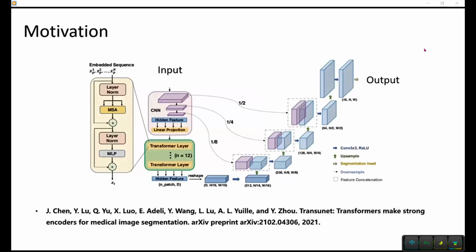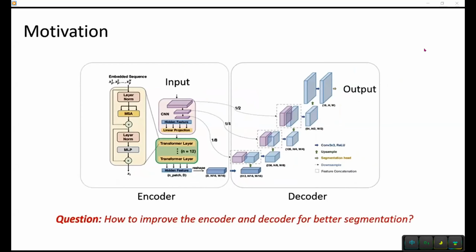The current baseline model for segmentation is TransUNet, which is a typical encoder-decoder model. It includes a powerful global information capturing module called the transformer. However, training a simple TransUNet model often struggles to obtain satisfactory segmentation results.